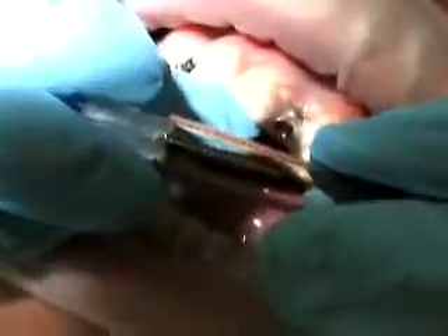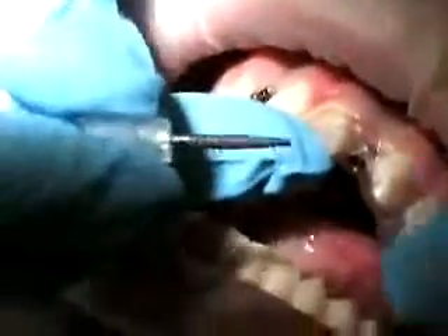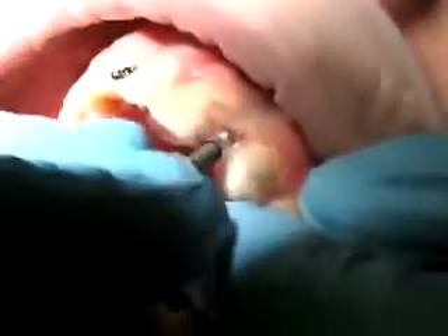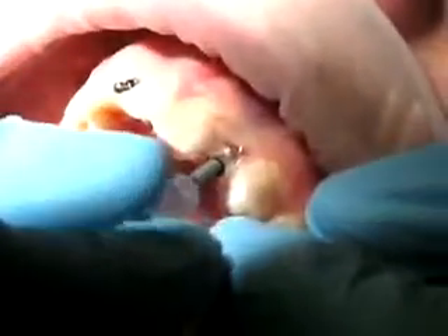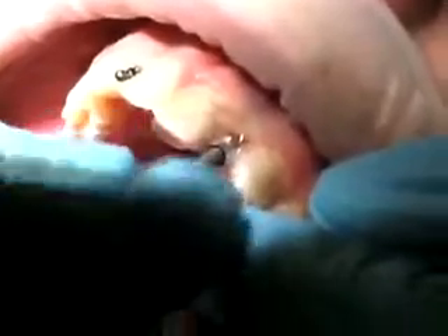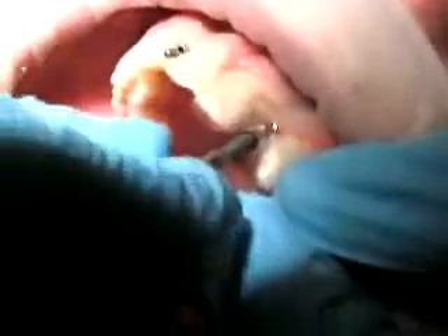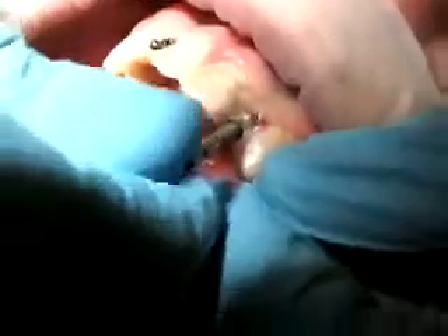Now open the mini dental implant and be sure to leave the little plastic cap on. Still working through the guide on the stent, begin screwing the implant into your pilot hole. As the implant takes hold, the pressure will increase and the cap will fall off. Next, you'll use a finger driver — this tool fits precisely onto the head of the implant and allows you to use more pressure to turn the implant in even farther. Continue until you cannot turn the finger driver by hand anymore, and now it's time to use the winged wrench.